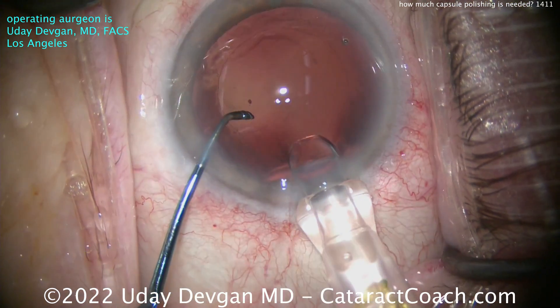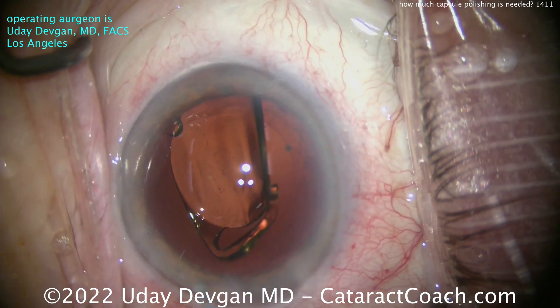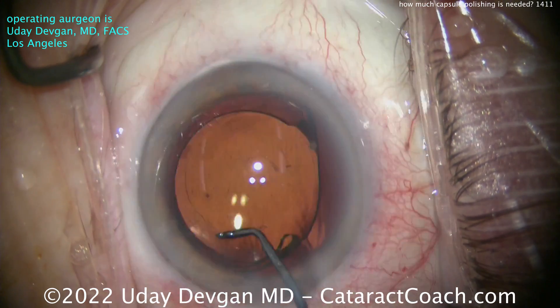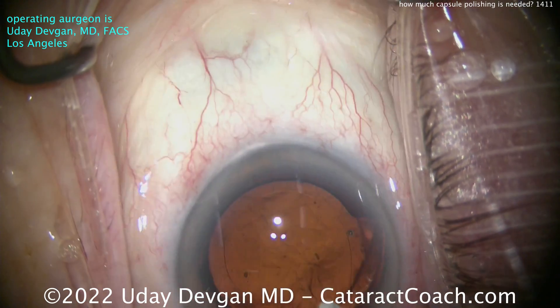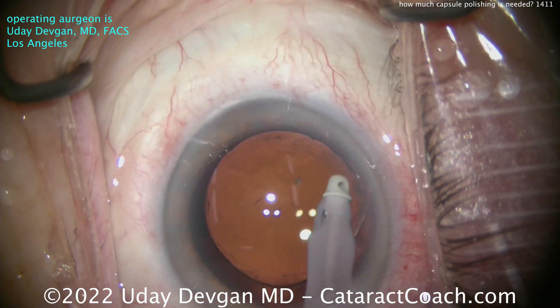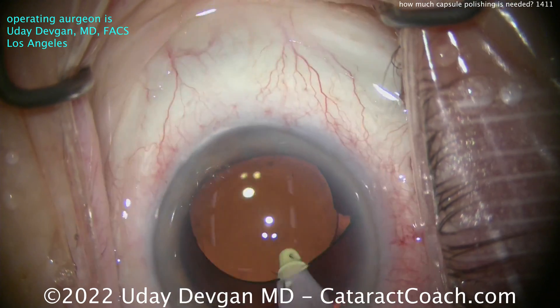Now putting the IOL in carefully. I can use that chopper instrument — it has a flat edge — to help scrape and polish the anterior capsule rim more if needed. But we have to ask ourselves: what is the balance? What we learned in med school was first, do no harm. A lot of that material on the anterior rim is pseudoexfoliation material already present on the outer surface of the anterior capsule, so it doesn't make any sense to go overboard polishing. This patient is going to have a beautiful outcome — a beautifully centered rhexis, and the patient was a +3 hyperope being corrected to plano.